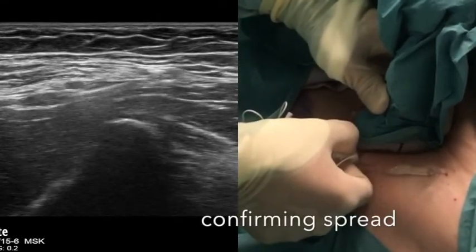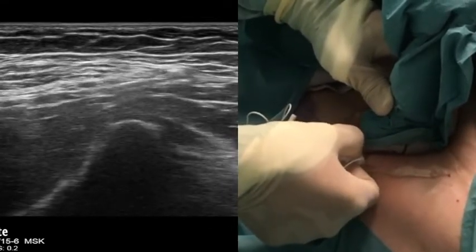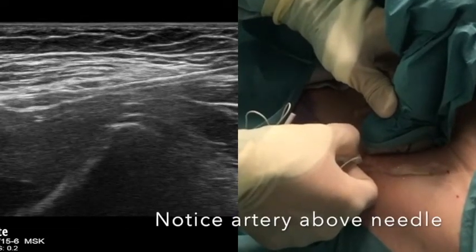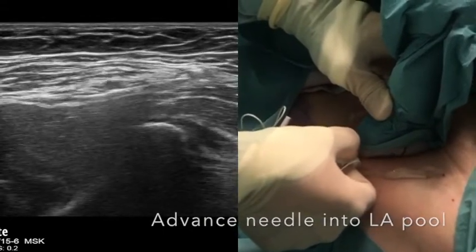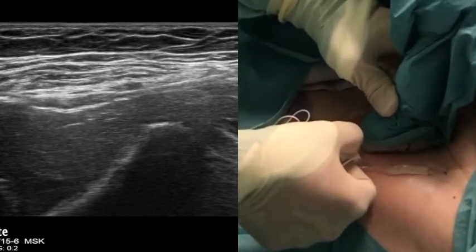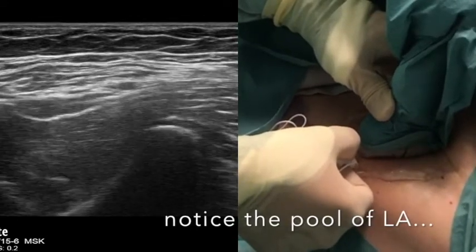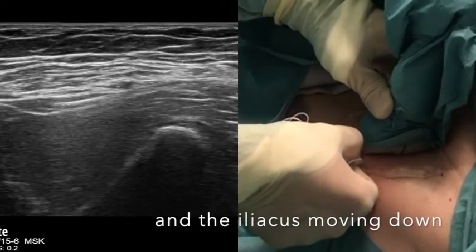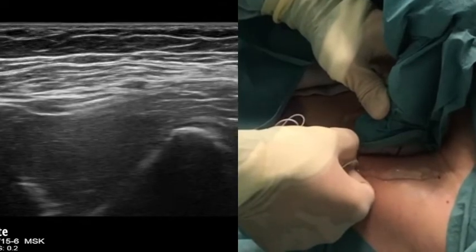The spread here looks good. There is downward displacement of the iliacus muscle and there is no honeycombing, which would suggest intramuscular injection. Once you have created a pocket of local anaesthetic, you can safely advance your needle into this to encourage proximal spread of the anaesthetic. Here you can see the bulk of the local anaesthetic being injected and the spread continues to look good on ultrasound. Your assistant will aspirate every 5 mills of injection and will tell you if the injection pressure becomes high. It should be an easy injection if you are within the correct plane.